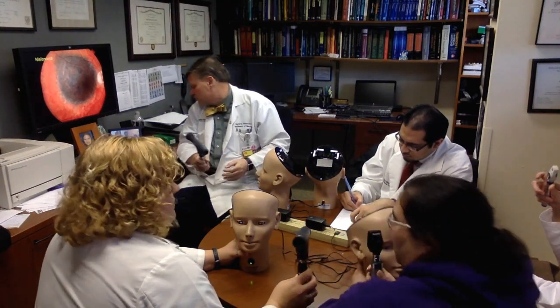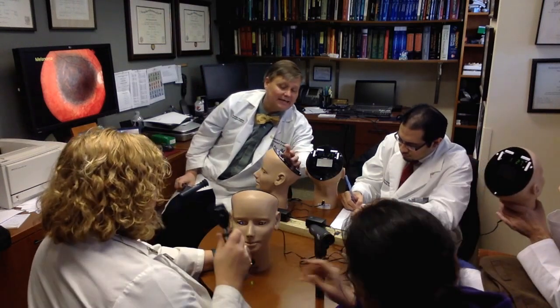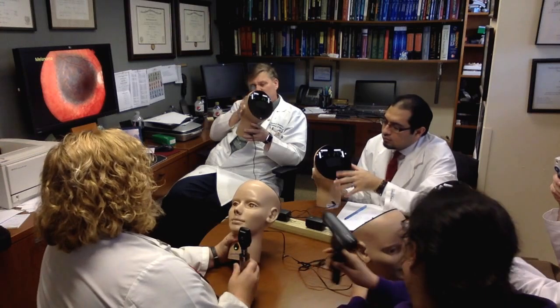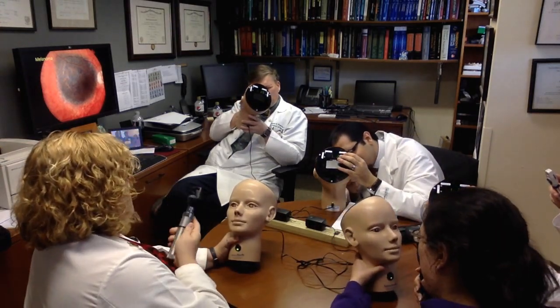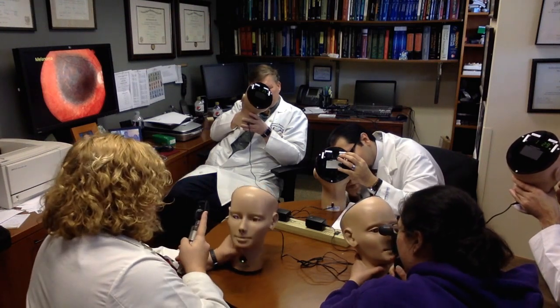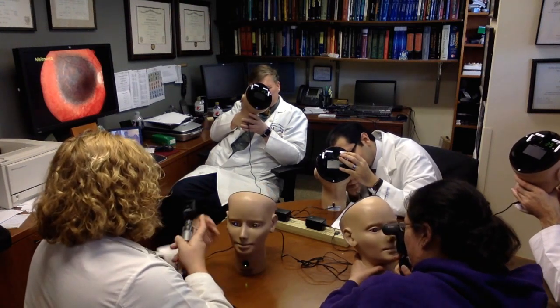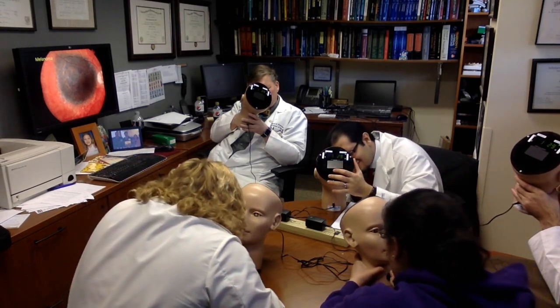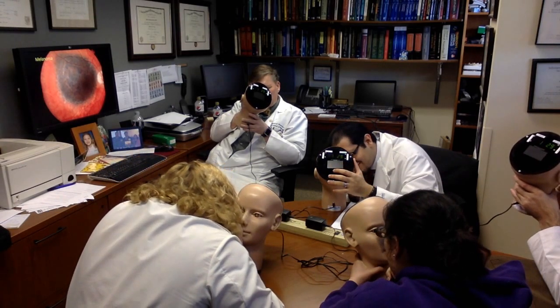Now contrast that to number 29. Okay, 29, and focus 10 feet away. Come in, and then focus again. And now it's kind of the opposite. You still see a blue-gray blob, right? But now you see the retina off to the right.